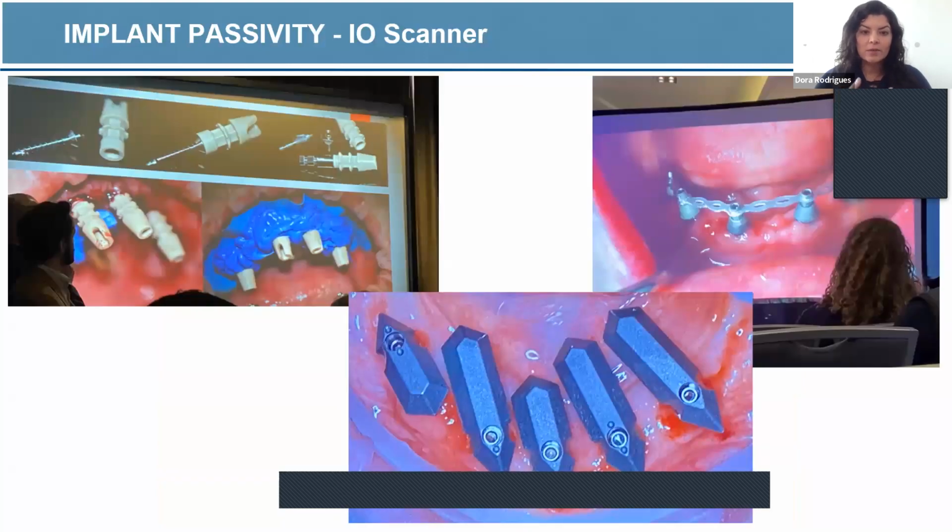And there are several techniques and workflows for full arch that include intraoral scanning. Again, this is from Facebook or from lectures that I attended, the Instaresa, Excel, even companies like Keystone Dental Group developed the Nexus. Basically they all serve the same purpose: capture the implant position with scan bodies and avoid having the tissue give you inaccuracy.